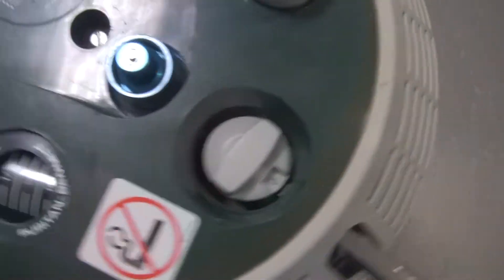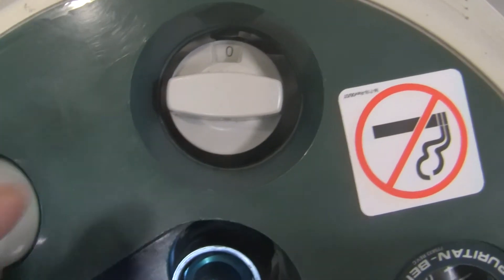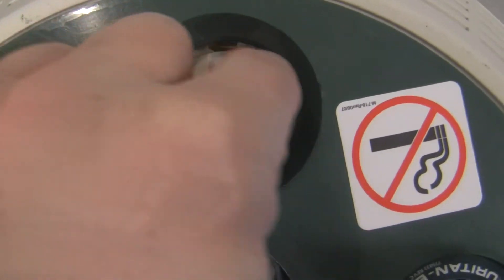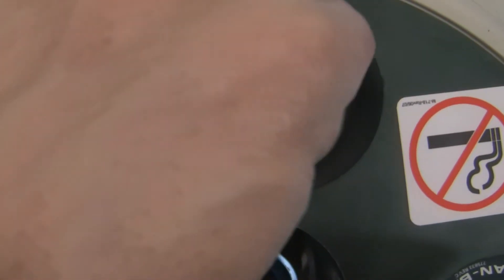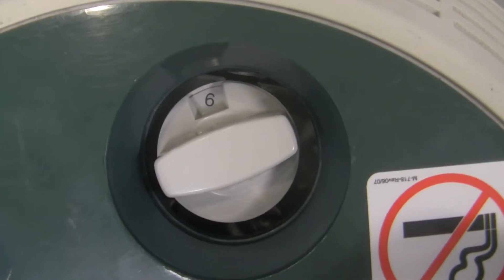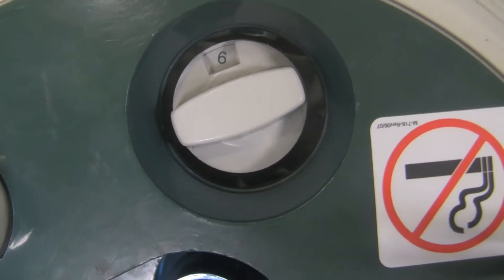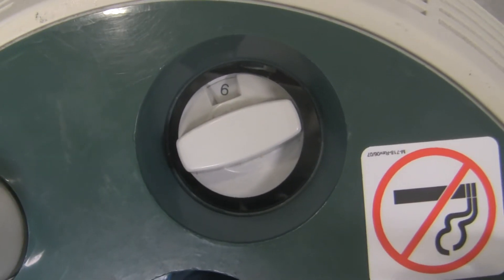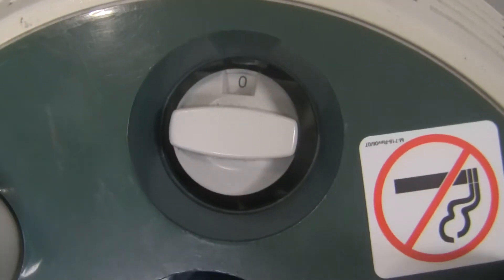Another part is the flow meter — it's a flow restrictor style flow meter. To get the gas to come out of the device and go to the patient, grab the flow meter knob and turn it to whatever flow you want. This one goes as high as six liters a minute, but you can get flow meters on these containers that go up to 15 liters a minute or even higher. When you're not using it, shut the flow off and make sure it's set to zero.